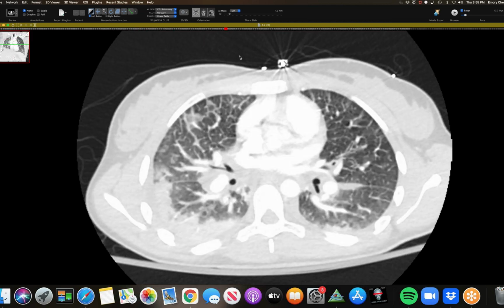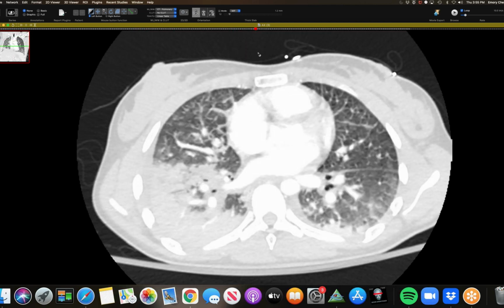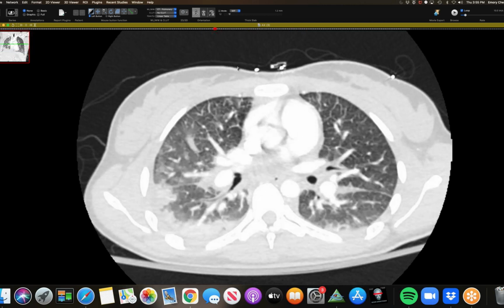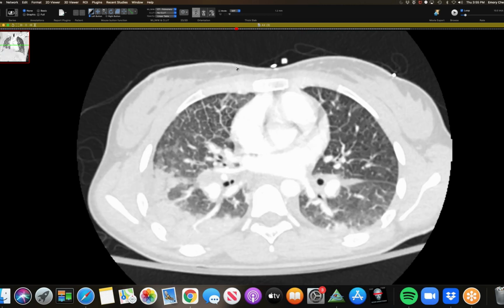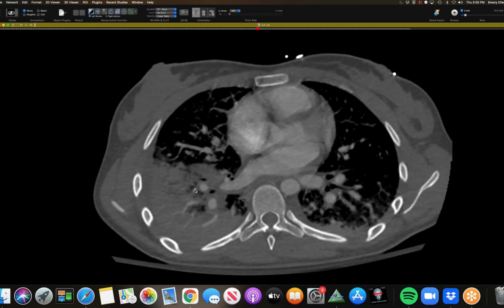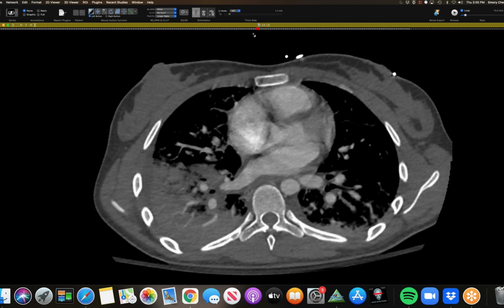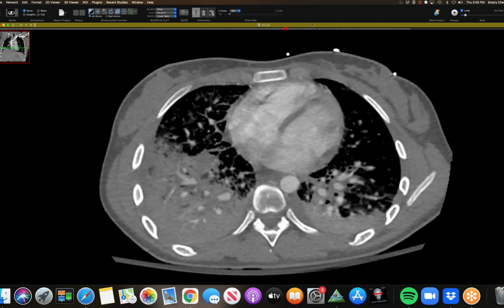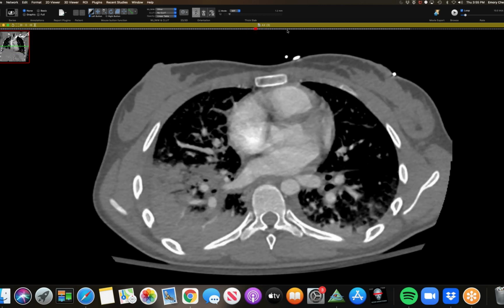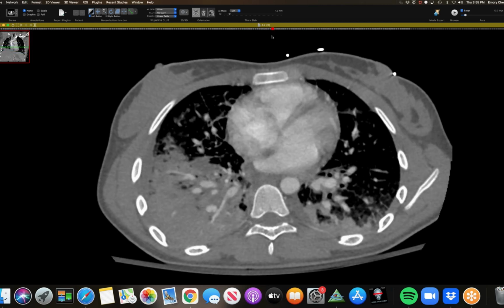So with that combination, they diagnosed her with toxic shock syndrome, and I basically told them this is going to be permeability edema from toxic shock syndrome. So this is not actually a pneumonia. Actually, you wouldn't expect that. So this is not strep pneumo, it's strep pyogenes.